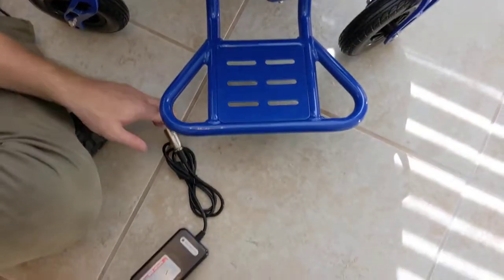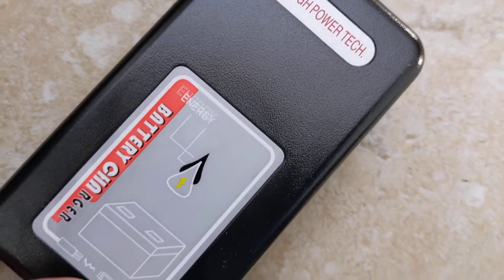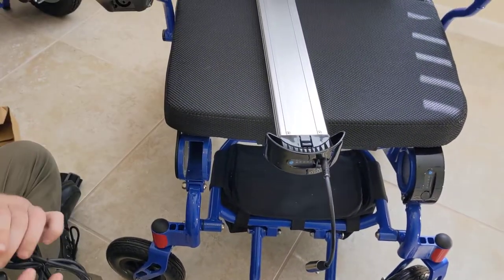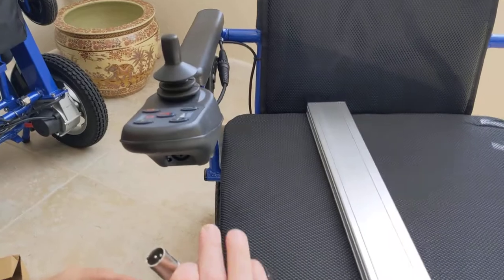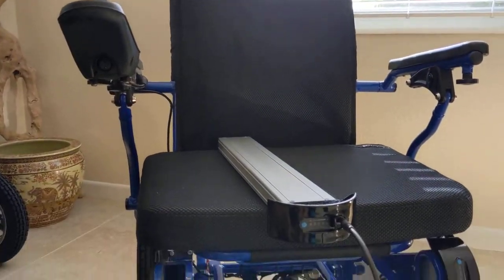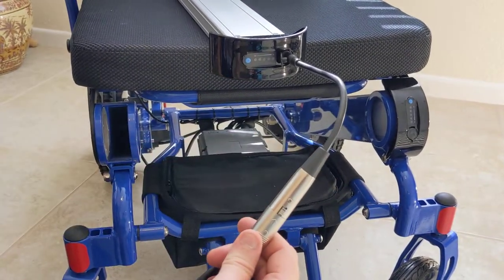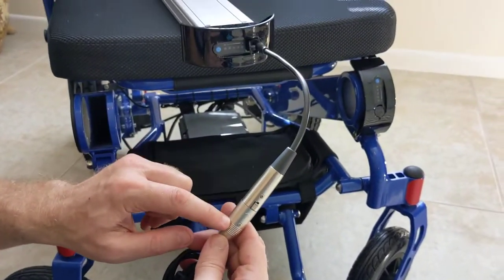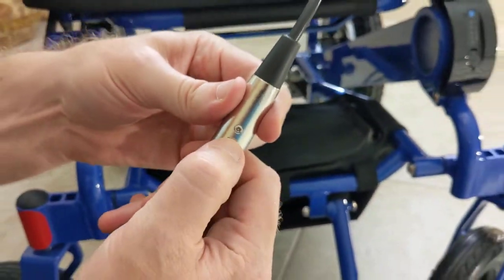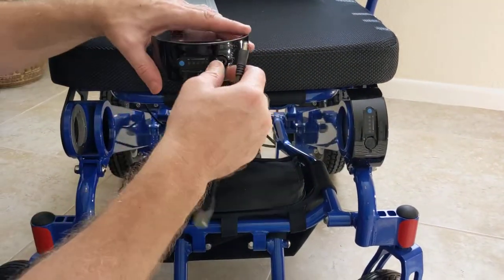The charger that comes with the chair is an international household charger, so you can plug it into a 110 or 220 volt outlet. If you want to charge both batteries at the same time, they need to be in the chair and the charger plugs directly into the front of the joystick. To charge one battery at a time outside the chair, just plug the charger into the wall and into the pigtail attachment on the battery.